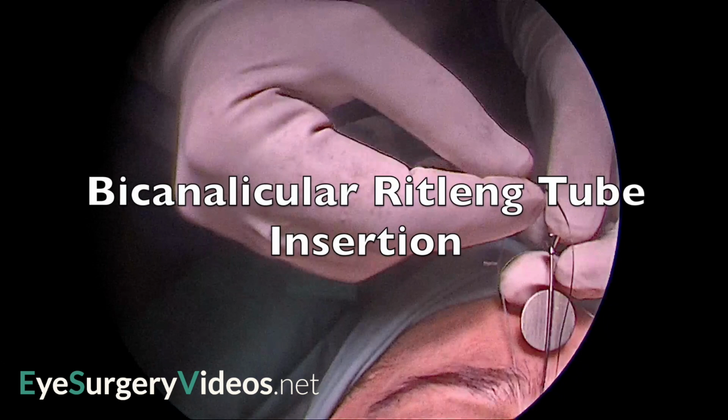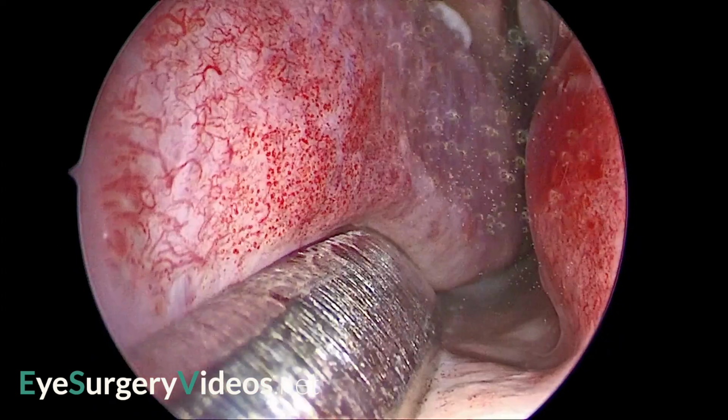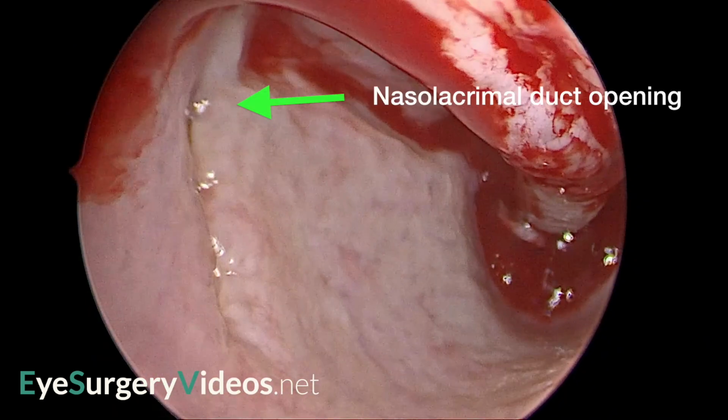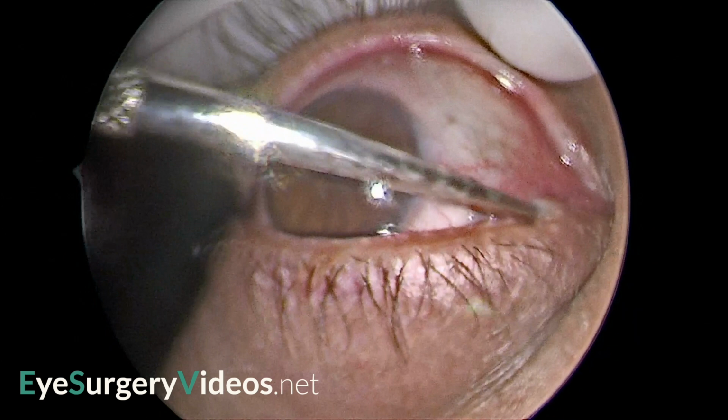The nasal cavity has been decongested. The terminal opening of the nasolacrimal duct is typically located around 1 centimeter back in the lateral wall of the inferior meatus, under the inferior turbinate, although the site and nature of the opening are variable. It is helpful to identify the opening at this early stage, so that later it can be confirmed that the stent has emerged through the natural opening and not through a false passage.